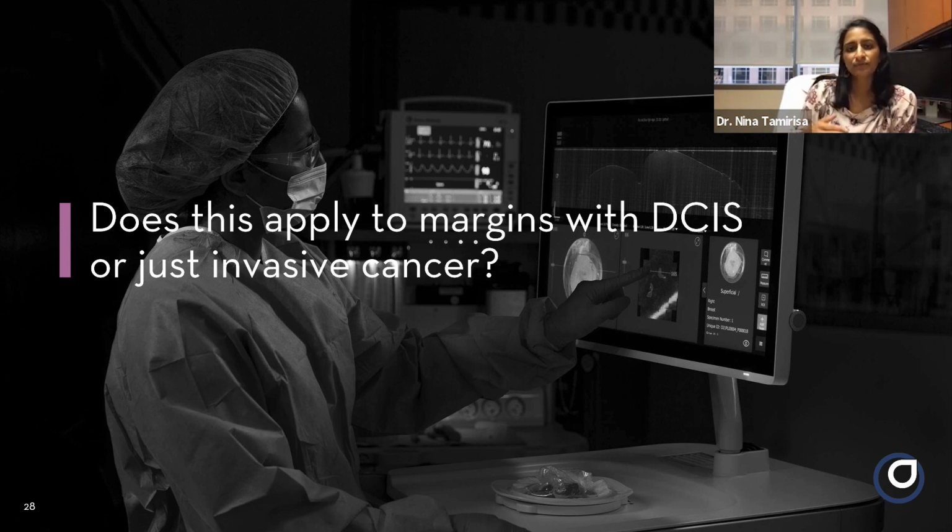You're only going to go so far before you decide to stop, but that can really help in the conversation with the patient, at least initially after the surgery, to say, it looks like we may have a positive margin. We may have to end up going to surgery for either mastectomy or another re-excision, but it looked like it was pretty extensive just based on the intraoperative assessment.